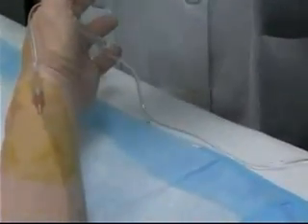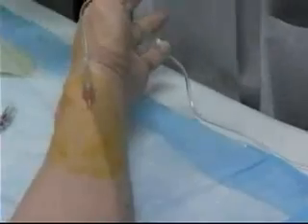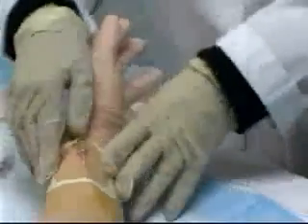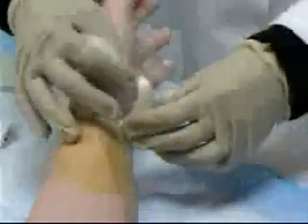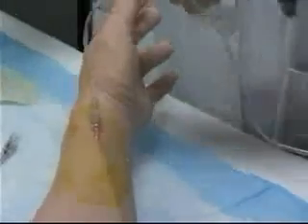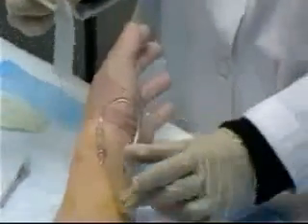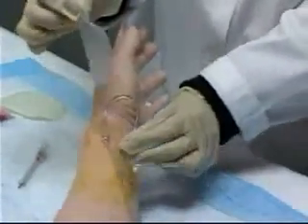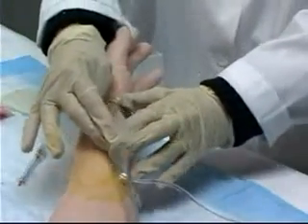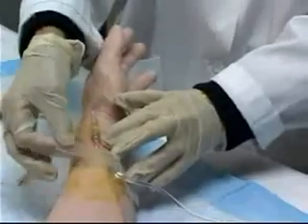Final step is to cover the insertion site and the connection with the occlusive dressing. Cover the site and peel off the side pieces. I can now tape the IV securely in place, making sure not to kink the tubing and pinch it off, but that I have access to that injection port there closest to the insertion site.